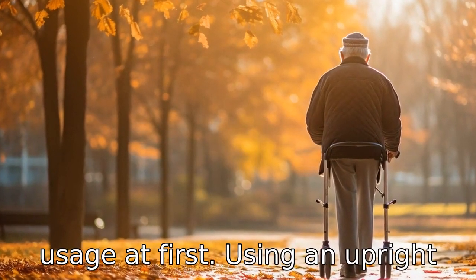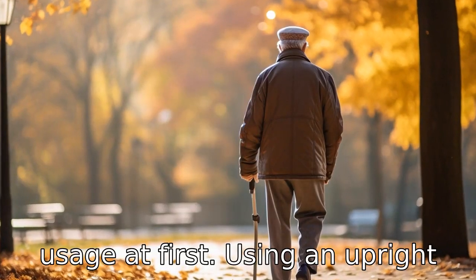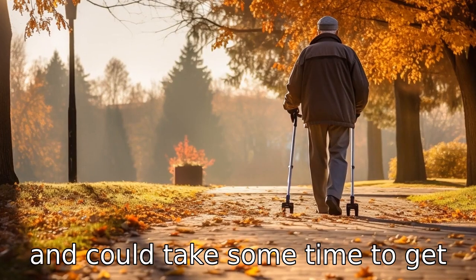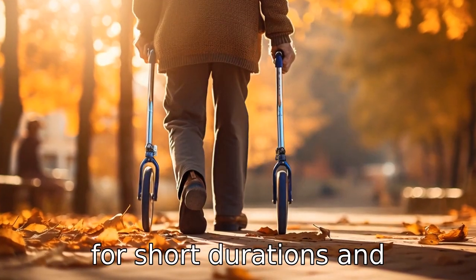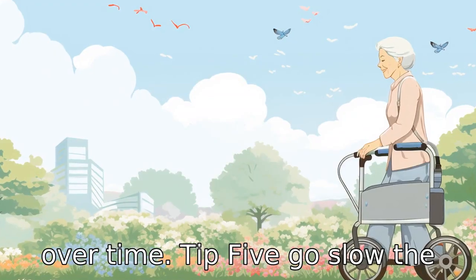Tip 4: Gradually increase usage. At first, using an upright walker may feel a bit strange and could take some time to get accustomed to. Initially, seniors should use the walker for short durations and gradually increase the duration over time.